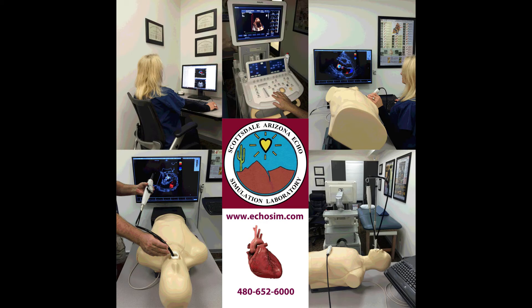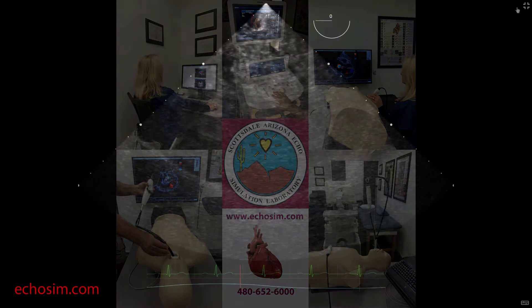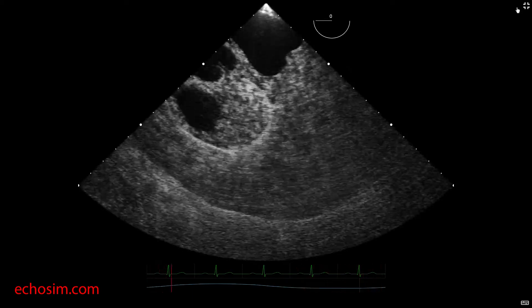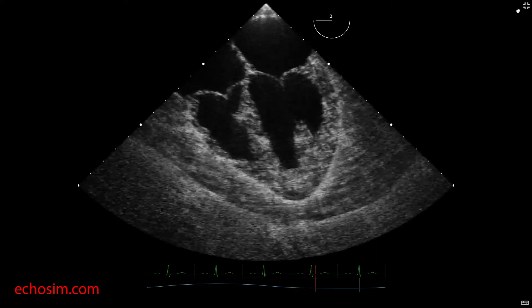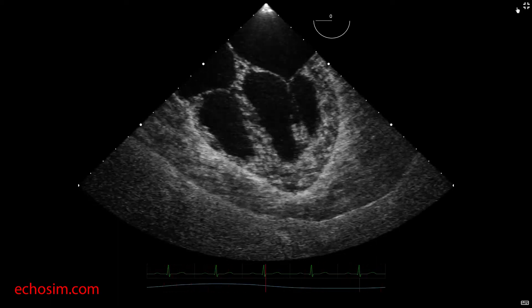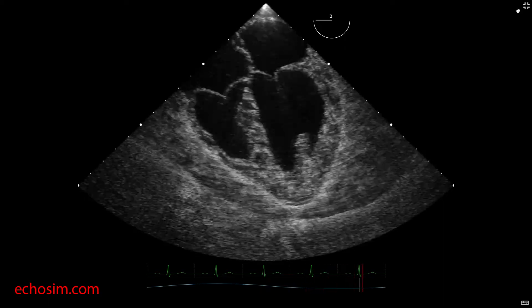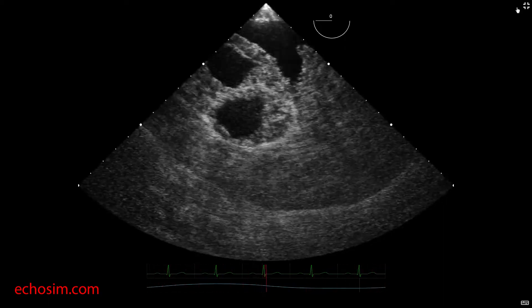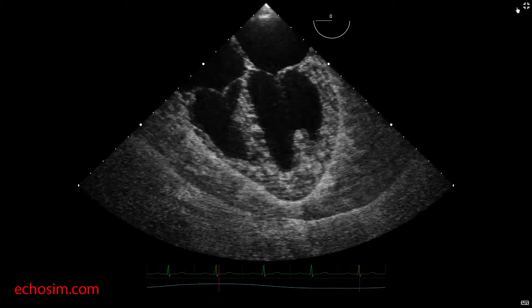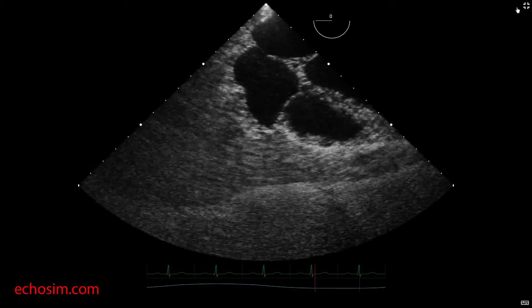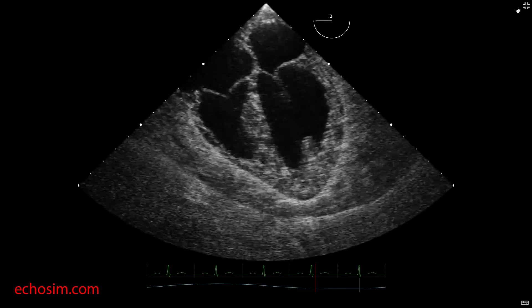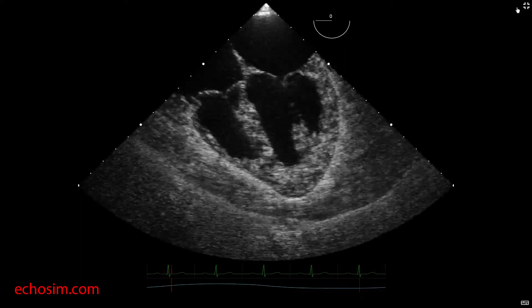The first and most important view of the exam, also described as the home view, is the mid-esophageal four-chamber view. Acquisition of this view includes finding the maximal area of the left atrium and a non-foreshortened view of the left ventricle. Maximal left atrial area is obtained by first centering the left atrium with probe rotation and then adjusting the probe depth to find the insertion level at which the left atrium appears to be maximal in size.